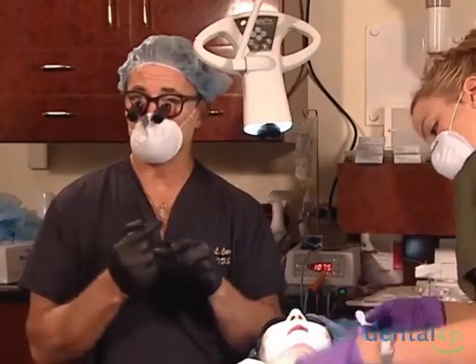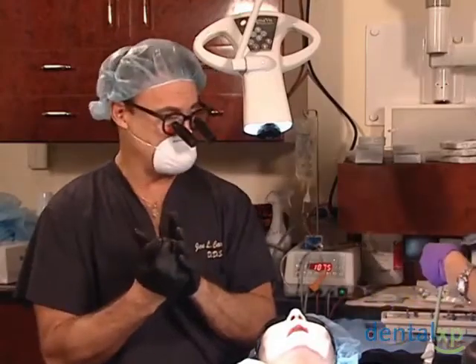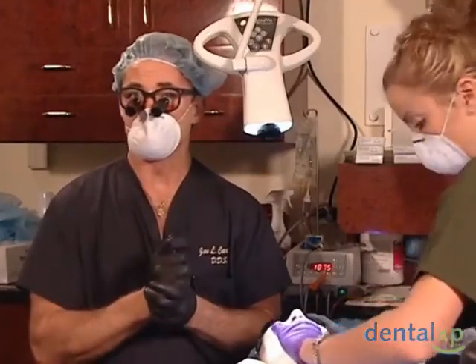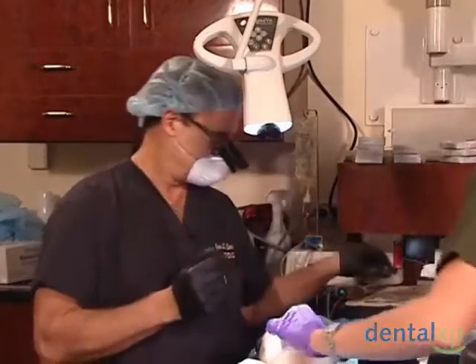Also, since the tissue is covered in many cases, you'll be able to feel if the burr is actually outside bone, because it will vibrate on the finger in that area. What happens if that happens? You simply take it back out and reorient it in a position where you don't feel that sensation.